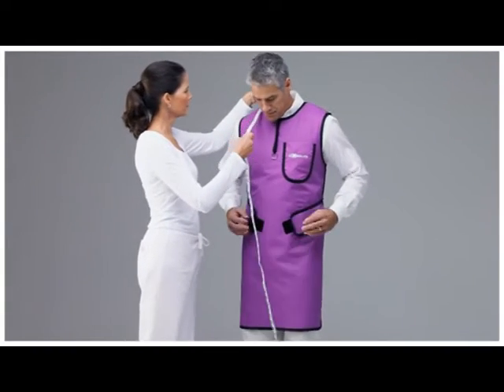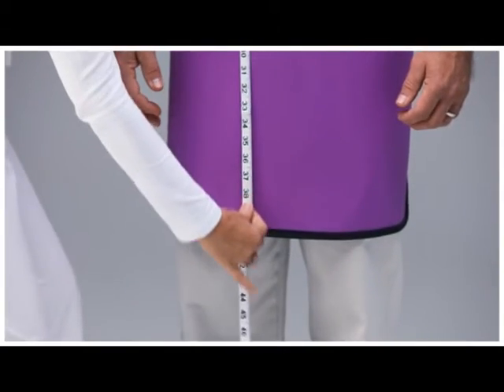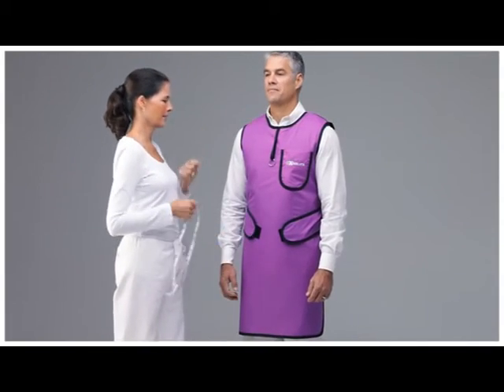For one-piece frontal and wrap-around aprons, simply measure from the highest point on the shoulder coming over the chest and ending just above the knee. Remember to stand as straight as possible while looking straight ahead.